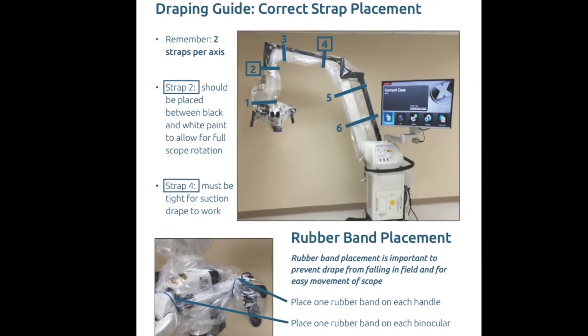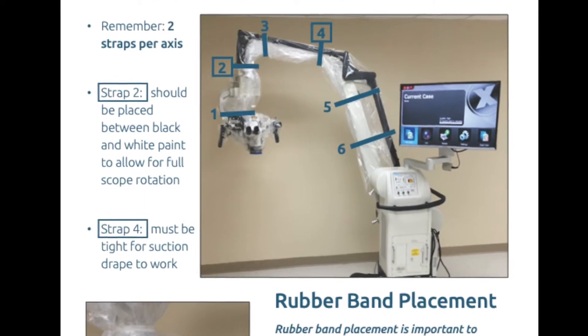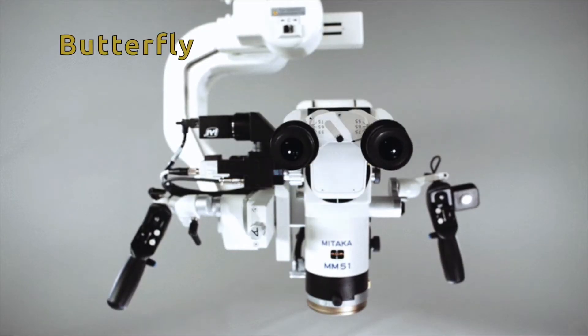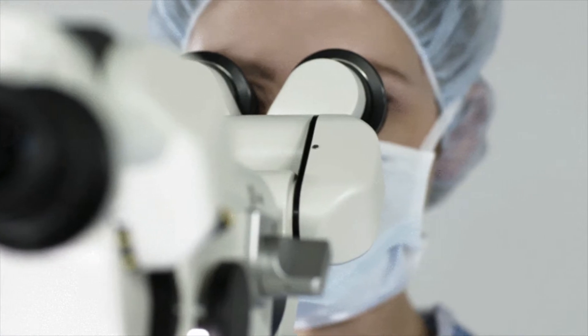When draping this microscope, it is essential that you follow your included one-page guide for the correct strap placement. Remember, it is possible to butterfly the binoculars up or down after draping the microscope, but not to rotate them. Please ensure best binocular position before draping the microscope.